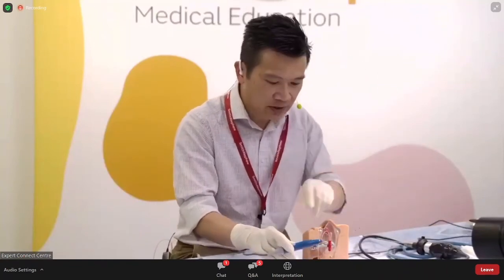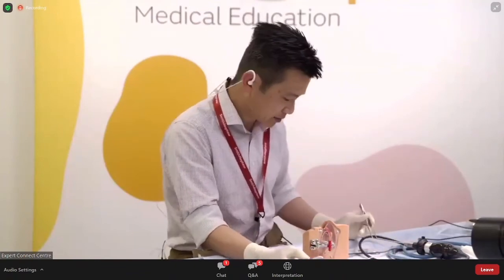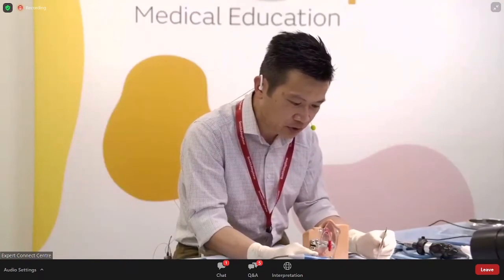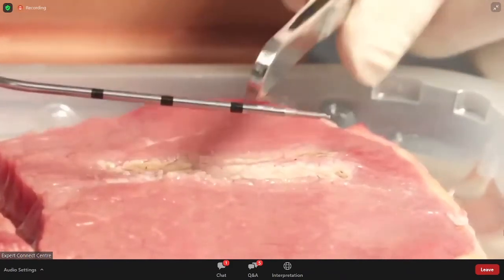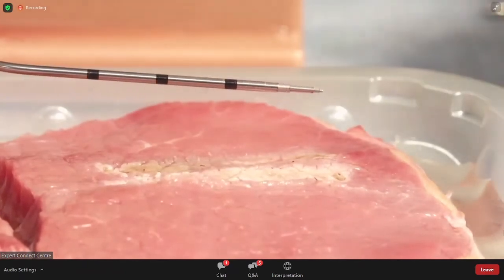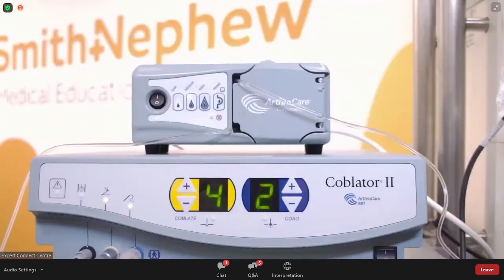I'm just going to put the endoscope down. And again, I'm just going to show you what the tip looks like. And you can see it hasn't got the irrigation port to this. These markings here tell you how deep you are within the inferior turbinate. And this again is a plug and play instrument, and we'll just go onto the power console to show you. There you go. So this is the default setting for the Reflex 45. It's 4 and 2. And certainly when I was using this regularly, we've never needed to change the settings whatsoever.